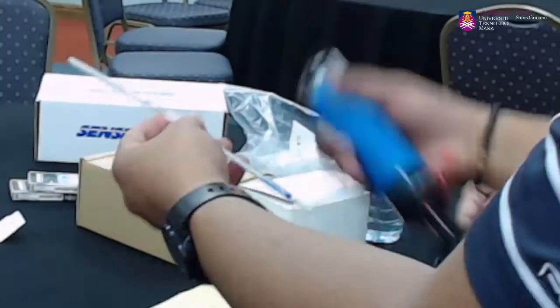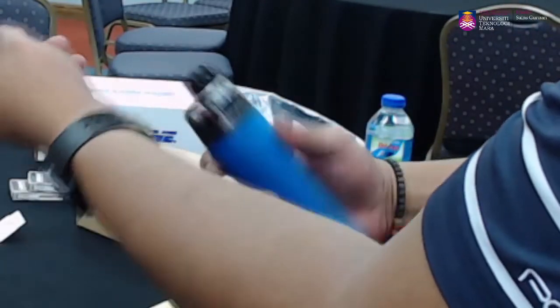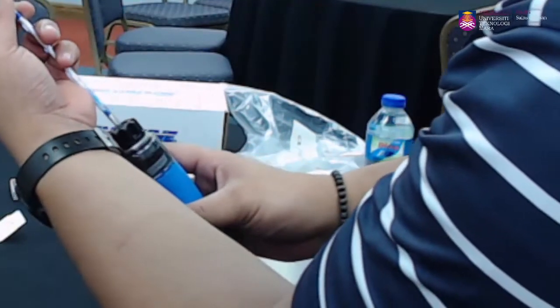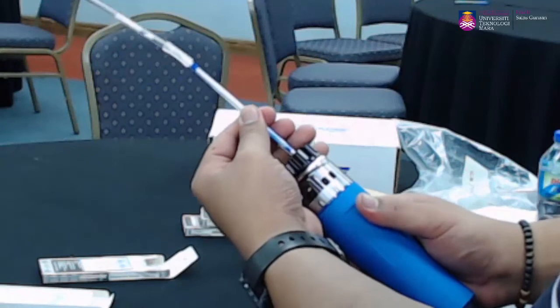Daripada sini just masukkan in terms of the arrow tu masuk ke dalam kita punya pump. Okay, kita dah insert, tak payah force lah. Kita dah make sure dia dah insert masuk.